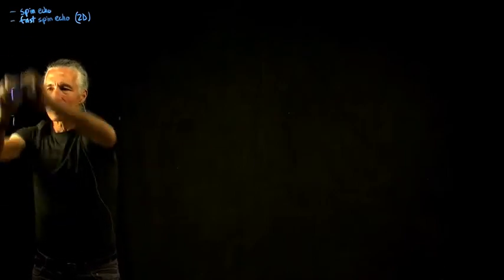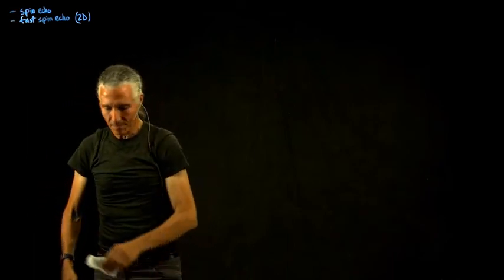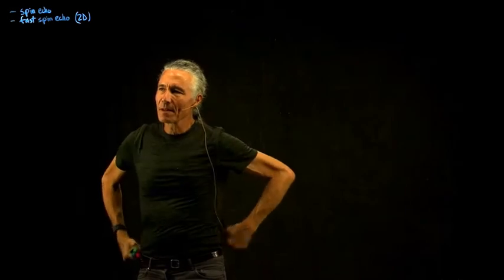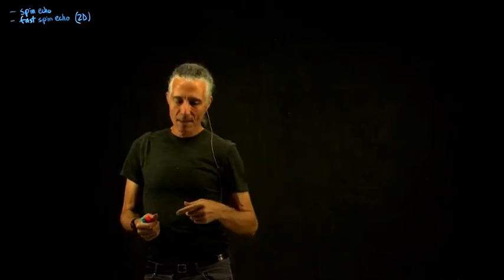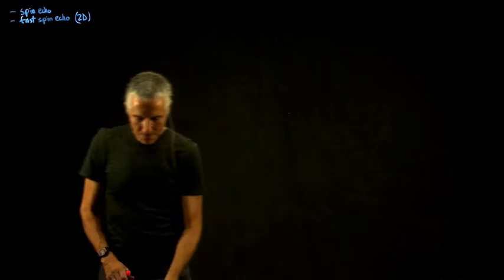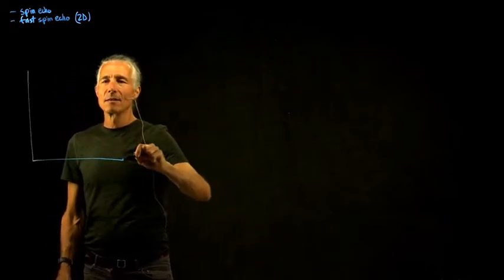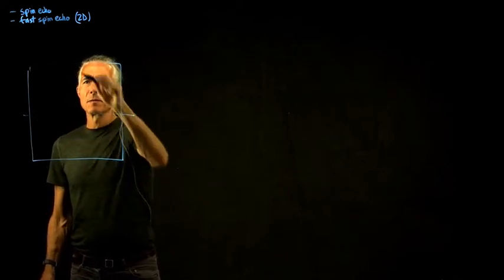And you could sort of think of this as one of the early versions of something like echoplanar imaging, where you record a whole bunch of lines of K-space at once. And so for this method, we, however, have to sort of take into consideration where we ended up in K-space at each point in time.